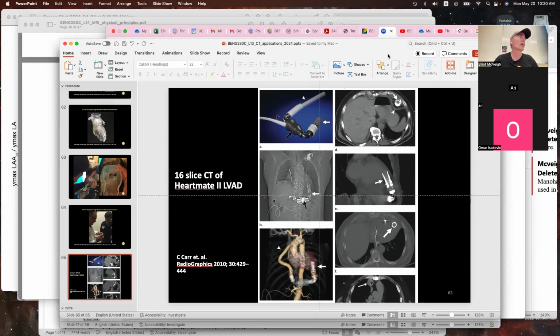Okay, thus ends our discussion of CT applications in cardiac. Those are pretty deep about specific problems, right? And the thing we touched on and looked at, which is probably the most common use of CT in the heart, is imaging coronary arteries, right? Because that's the gold standard diagnostic thing you want to know: does this person have a really bad lesion in their coronary artery? And if you think back to those pictures, those are really important, right?